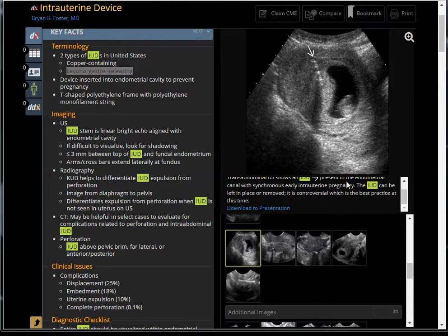Sometimes the IUD doesn't work. For example, this one — probably the Mirena type — shows just a few echogenic lines, not much reverberation, and there is still a gestational sac right next to it. So basically, you can still get pregnant with an IUD in place.